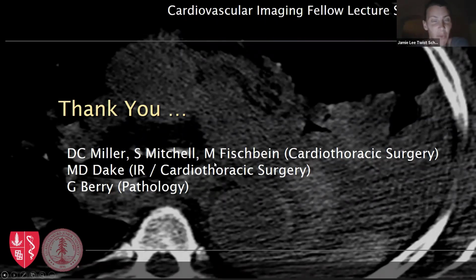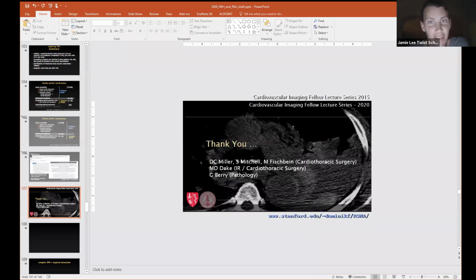Sure, I had asked a question earlier when we were discussing the PAU case. The last PAU case you had was in the arch, and it had progressed past the adventitia. You talked about this hierarchy of the PAU versus progressing to aneurysm or pseudoaneurysm with some sort of rupture. In my experience, the surgeons are more likely to jump when you say pseudoaneurysm, especially if you talk about some leaking of blood, compared to just a PAU, which they might wave off because they think all ulcers might be a little bit the same, or they don't think a PAU is on their urgent spectrum in the same way.